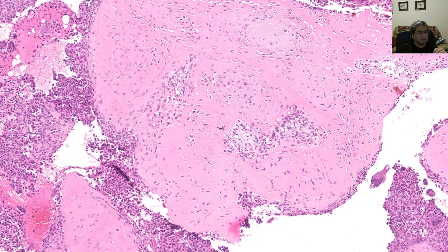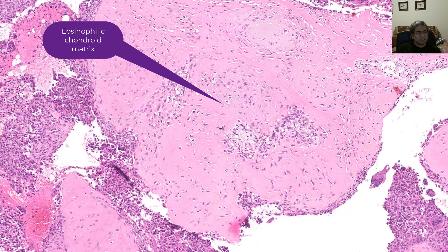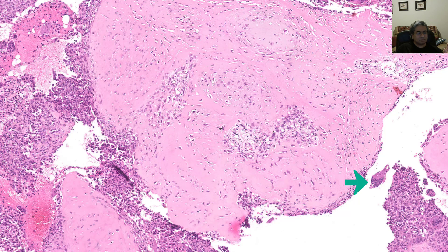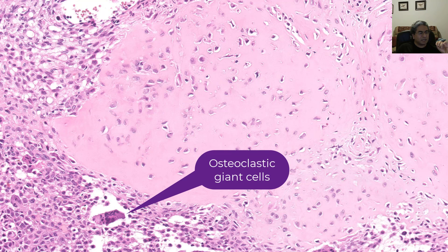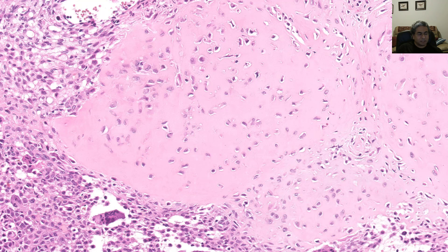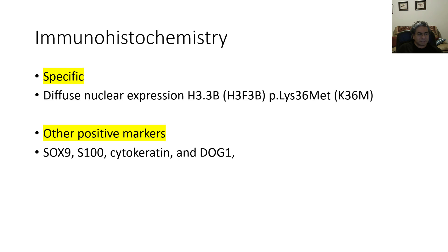Here's another example of these rounded fragments of tissue with this eosinophilic chondroid-type matrix. Notice there are a couple of osteoclast-type giant cells around as well. Another look at that eosinophilic chondroid matrix and osteoclast-type giant cells. The osteoclast-type giant cells are simply along for the ride — they are not the neoplastic constituent. The mononuclear cells are the neoplastic cells.